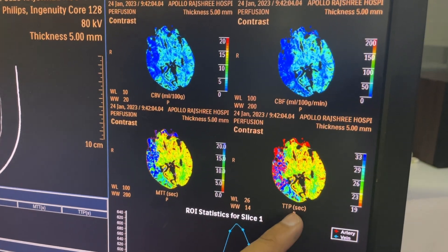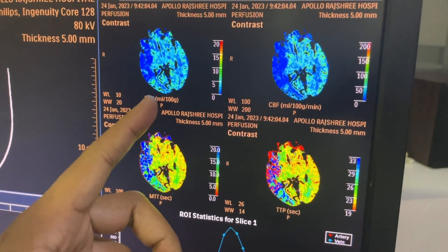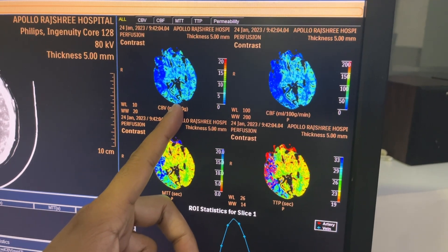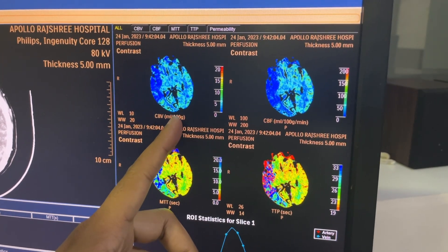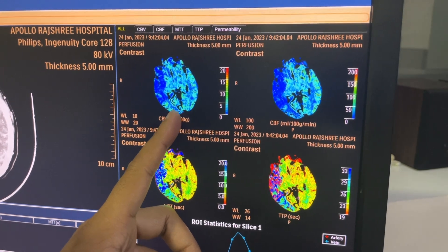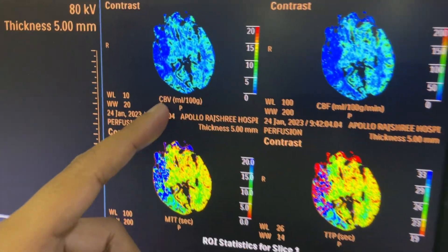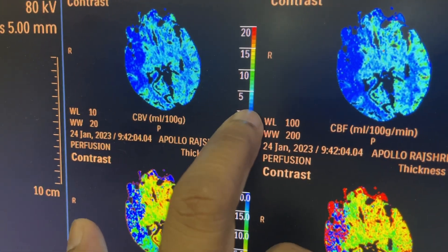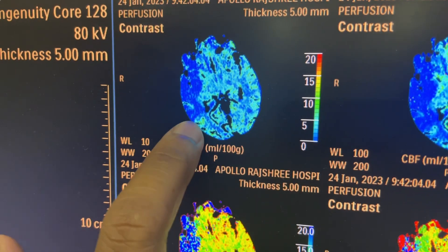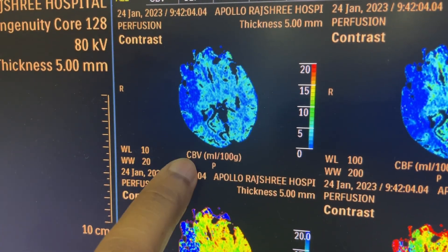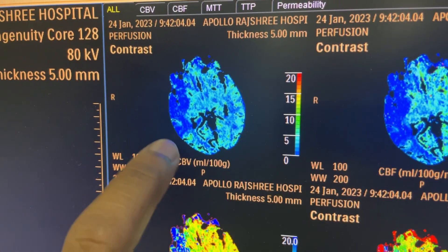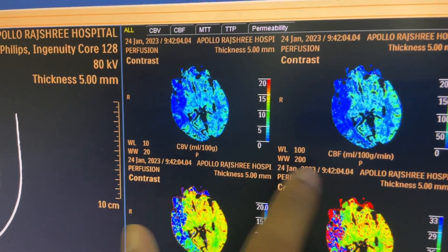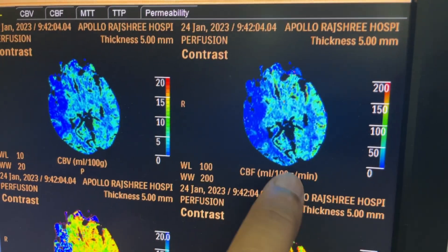Suppose an RBC starts its journey — blood is flowing here. How much blood is going through this part of the brain is cerebral blood volume (CBV). On the scale, the bluish color means zero blood flow, meaning in this portion of the brain the blood volume is almost zero — this portion of the brain is not having any blood volume.